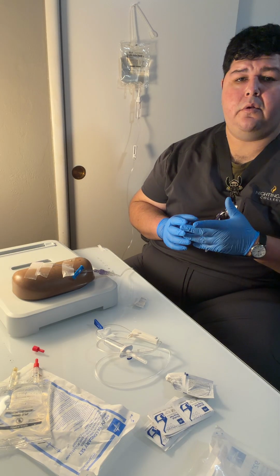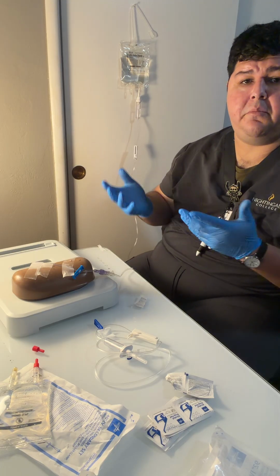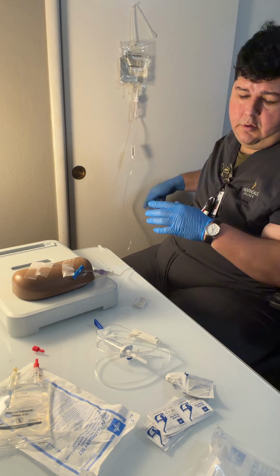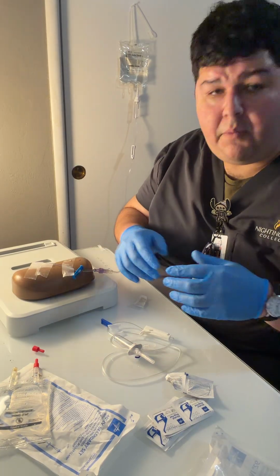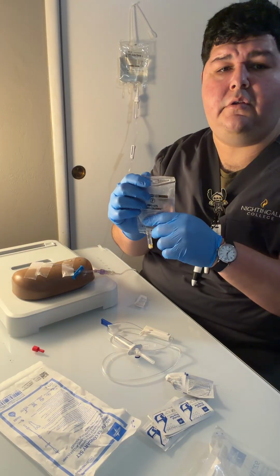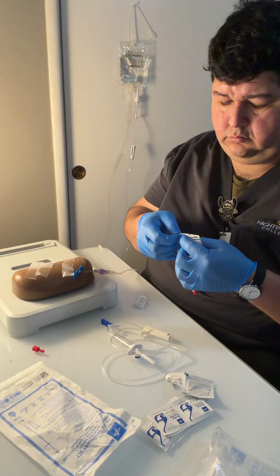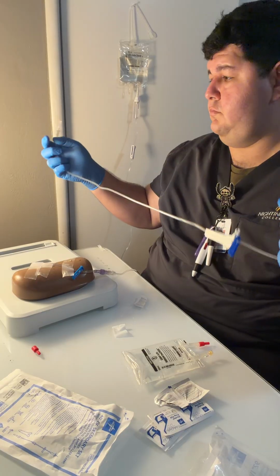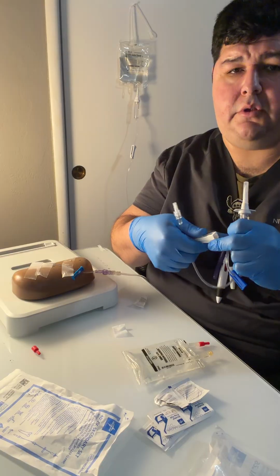And in the real world, I would allow this infusion to continue. But due to the limited supplies, pardon, I'm going to stop it. Then I would set up our piggyback, our IV piggyback. We have the amoxicillin. And then this is the secondary line. We want to start with the roller clamp closed.